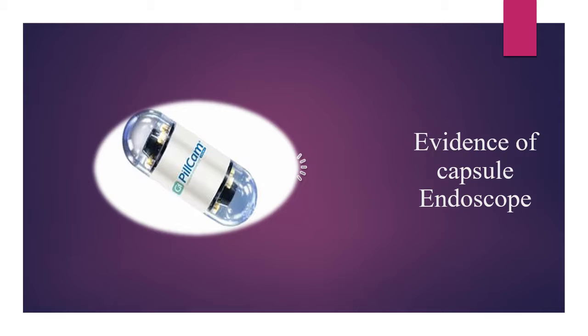Talking about the brief history of capsule endoscopy, Iddan et al. first proposed the concept of using a tiny camera as a pill for human GI tract imaging, which was further improved and ended up as a prototype of the wireless capsule endoscope in 1997. By 2000, Given Imaging commercialized the first WCE system, named PillCam. The product opened an evolution in endoscopy history with the opportunity of monitoring the full length of the GI tract and brought new challenges in identifying the exact locations of the acquired images.